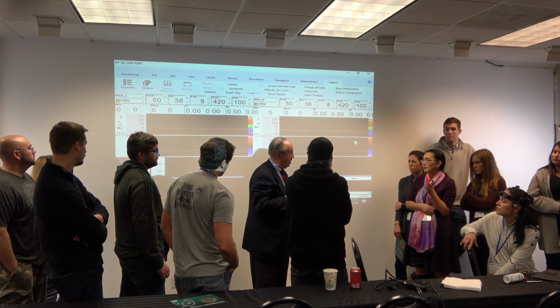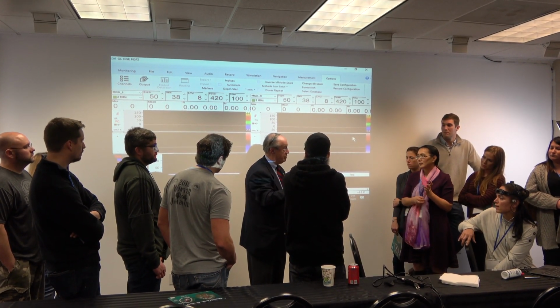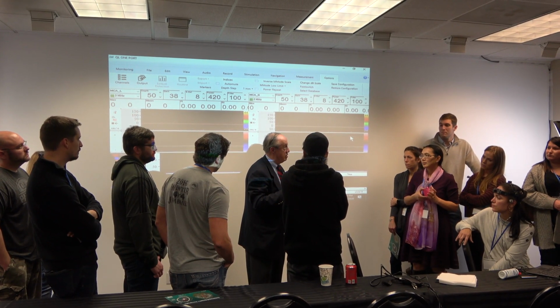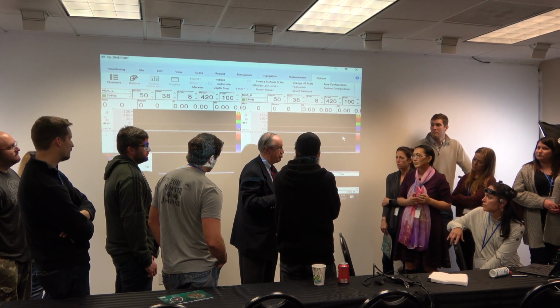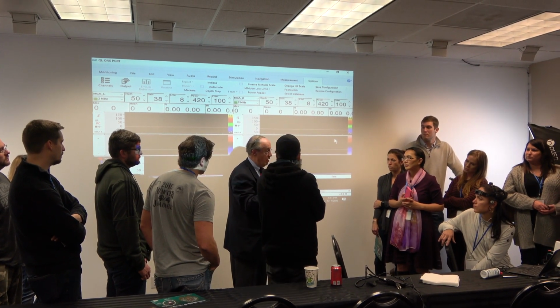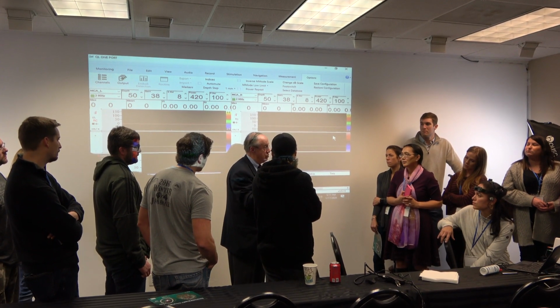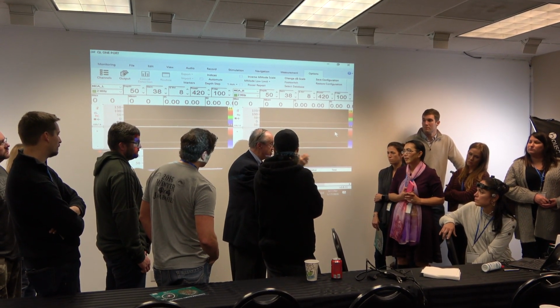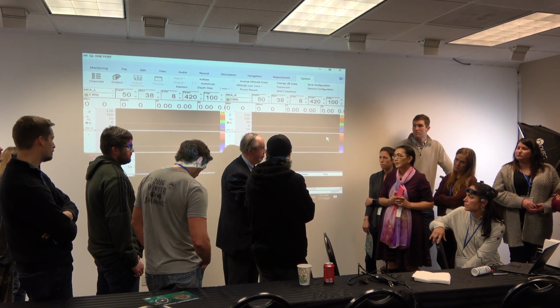So what Dr. Rune Aaslid from Norway with his colleagues from Switzerland did, they invented TCD in 1982. It was the first publication in the Journal of Neurosurgery about TCD. How did they do it? They created a pulsatile waveform. So the 2 MHz probe the tester has now here, they're working with pulse repetition frequency.